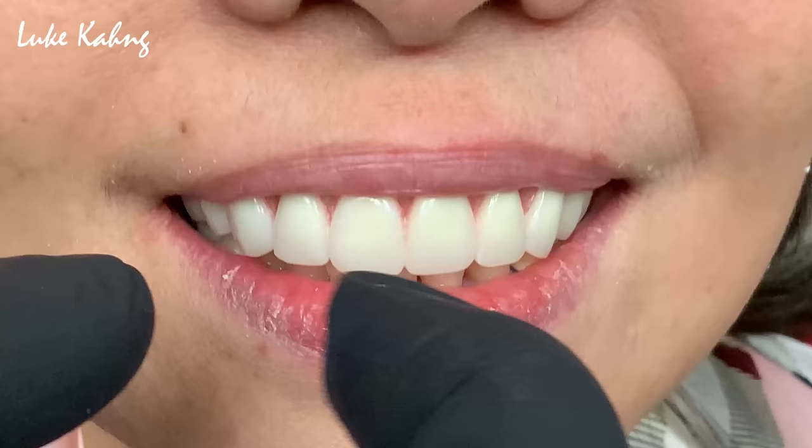Okay. And you can see that it also follows her smile right there. Look at that, it follows all the way in. Very nice. The teeth are not protruding out. They're nice and harmonious. See that? Good. Okay. Side view, like you said. Yep. Perfect. Just like that.